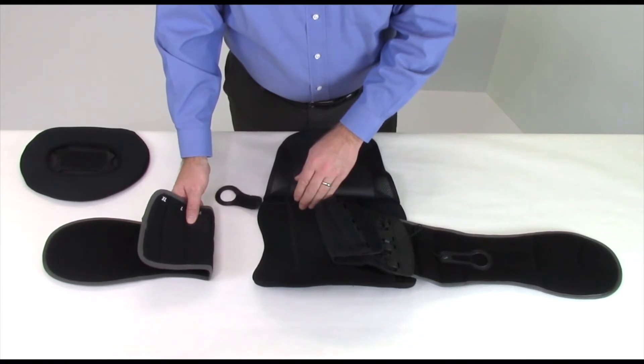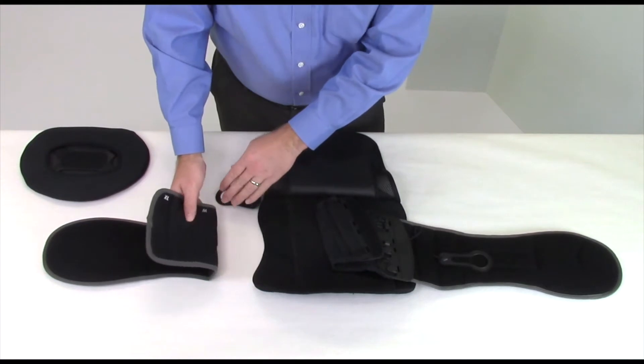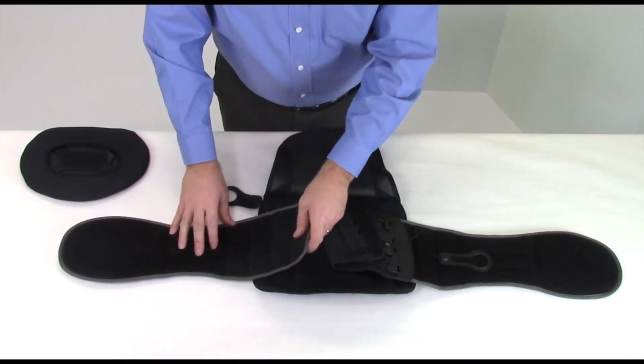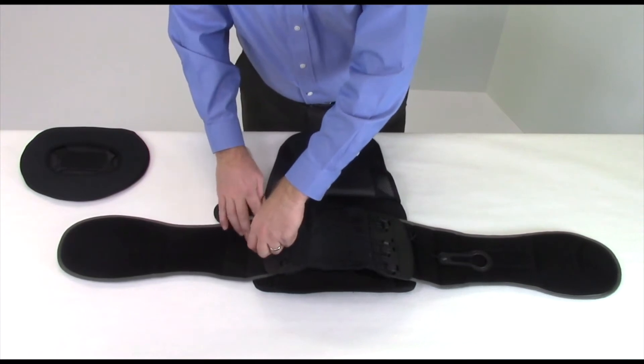Reattach the pulley cord frame and fasten the O-ring cinch strap loosely to the wrap panel. Repeat this process on the right side.